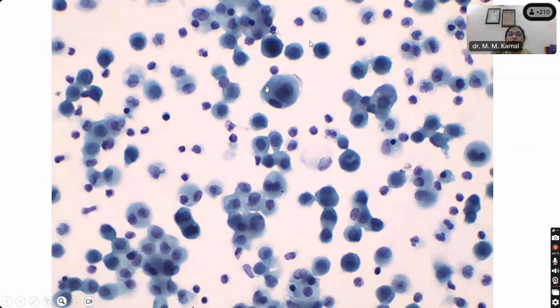Now what is this you are seeing over here? It is a mesothelial cell. Yes, it is a mesothelial cell, of course. It's binucleate or I think multinucleated, and plenty of binucleate cells are seen all over. And then you have this dual pattern, or accumulation of 3 cells together or 2 cells together, which is a very common pattern that you see. Here you can have a trail of cells.